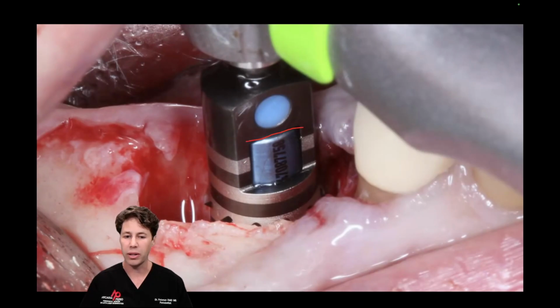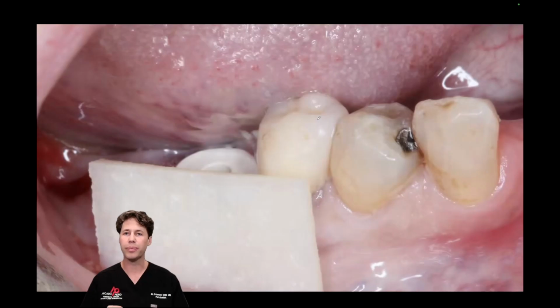These are in 1 millimeter increments. So you can see here I'm about 3 to 4 millimeters from the free margin and about 5 or 6 millimeters from the lingual aspect. So again, just all things that are built in that you may or may not be aware of when it comes to measuring these things out when you're working on areas clinically.